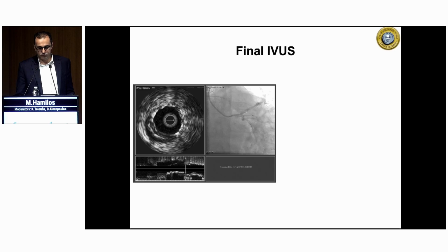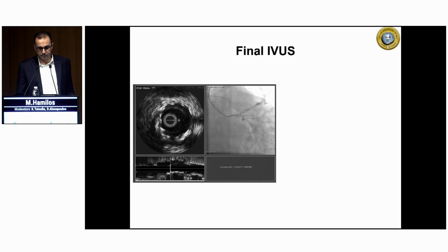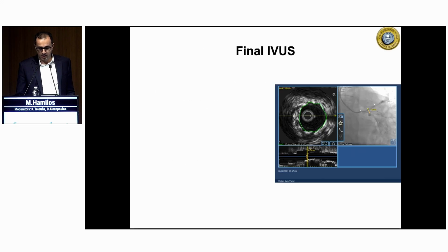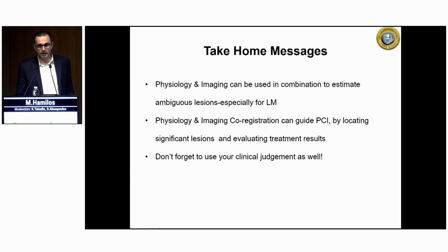This is the final IVUS with a good stent apposition and a good final angiographic image. And to finalize the case, the main message for me is don't forget to use your clinical judgment beyond all the imaging and physiology methods. Thank you very much.